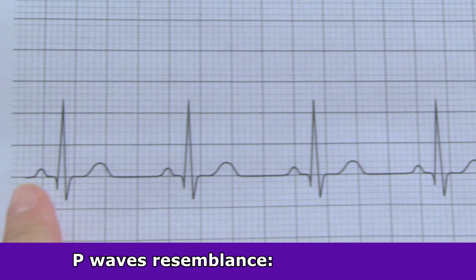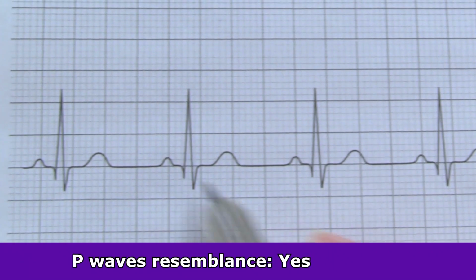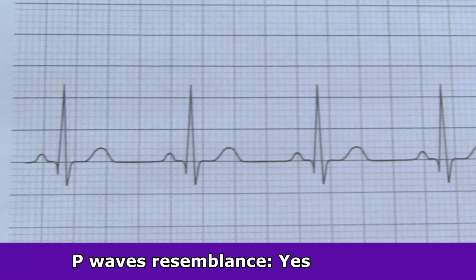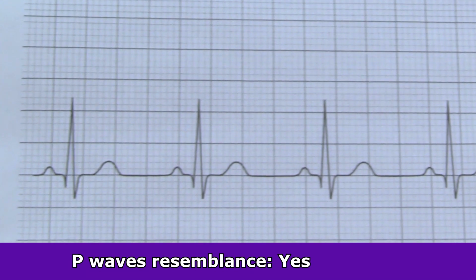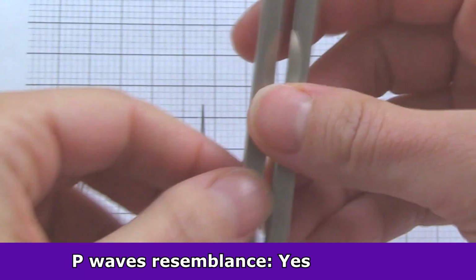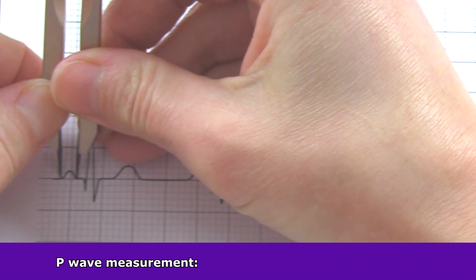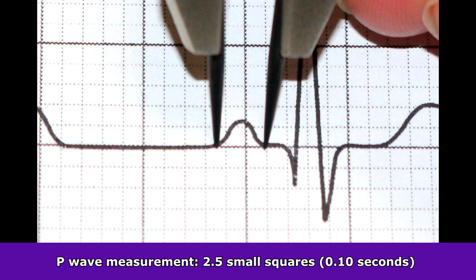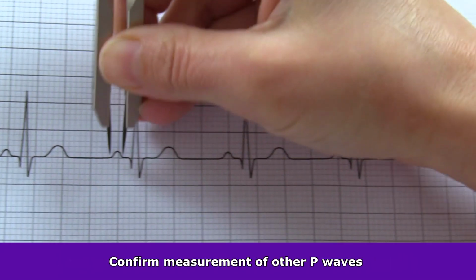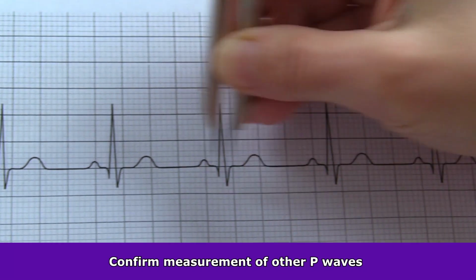Now let's look at their resemblance. Do these resemble P waves? And they do. They are round, they are upright, there's only one P wave in front of a QRS complex. And their duration, let's make sure that they're less than 0.12 seconds. So we're just going to take our calipers, measure at the beginning of that P wave and at the end of the P wave, and it's about 2.5 boxes, so we get 0.10 seconds. And then just to confirm that measurement, go throughout all the other P waves and make sure that they all line up with that measurement.